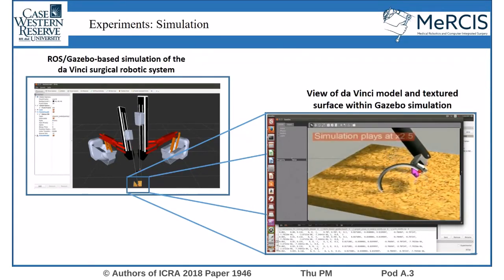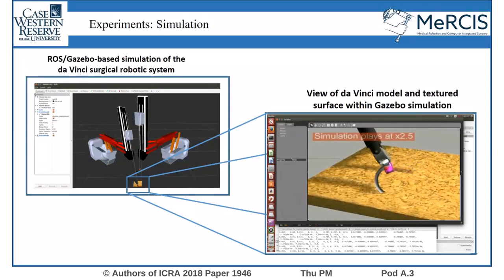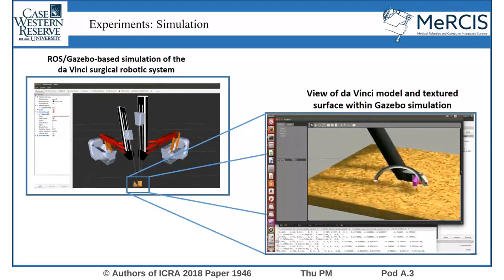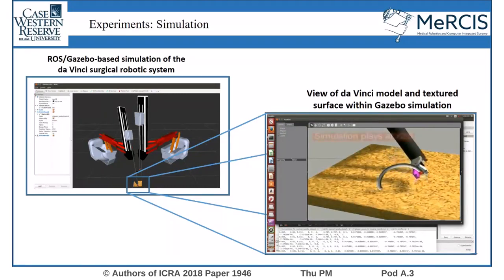The proposed method is quantitatively validated by evaluating the needle tracking accuracy under various noise conditions using a ROS-Gazebo-based simulation of the DaVinci surgical robotic system. This simulation environment provides a perfect baseline since the robotic calibration for kinematics and the joint sensor feedback are exactly known.